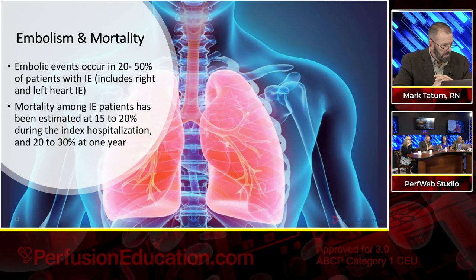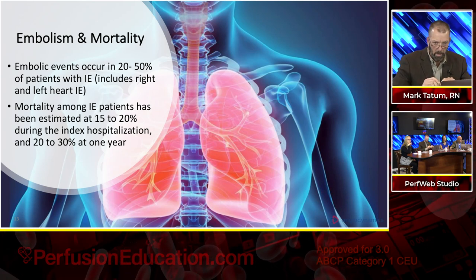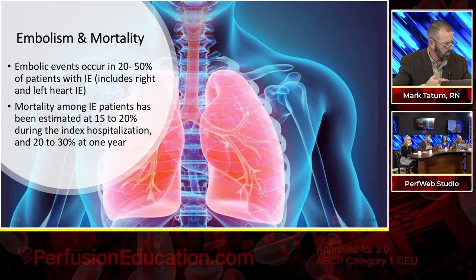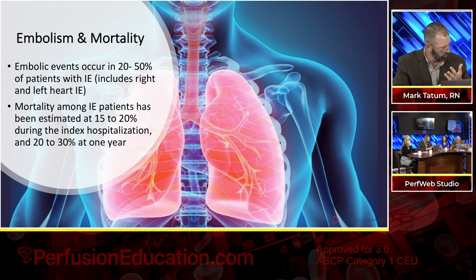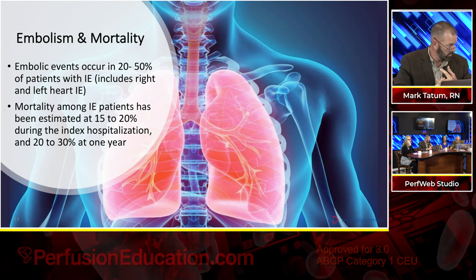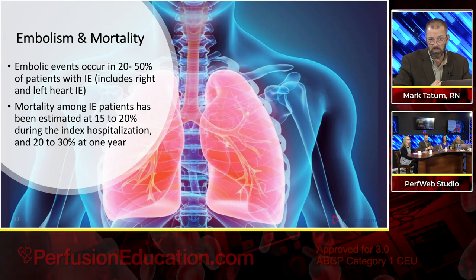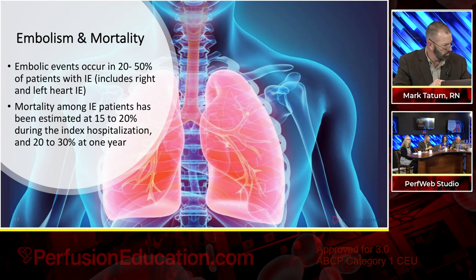Great. So clearly, the reason that we want to treat this and figure this out is because of embolic events. Now, we're not saying that if you treat this disease process using AngioVac as an example, that we're going to change the course of treatment as far as antibiotics are concerned. We're not trying to make a claim today that you should treat for less time or with a different antibiotic. We still want you to do blood cultures before you get started. We want you to know what organism you think you're treating, get them on antibiotics, and see what we can do to relieve the sepsis. There are other benchmarks that we look at, not the least of which is the size of the vegetation. HRS 2017 says that 2 centimeters or greater is when we should begin to address this problem. We'll talk a little bit about that when we get to the imaging portion as well.